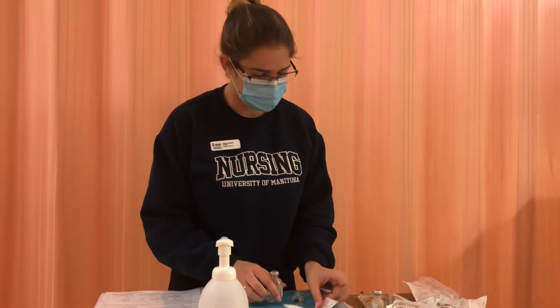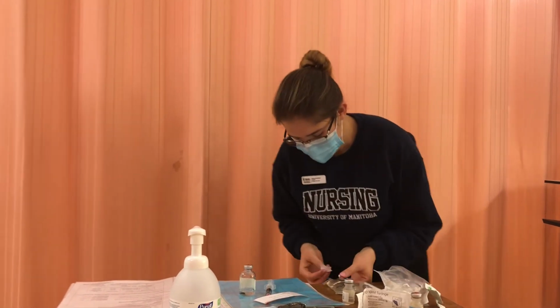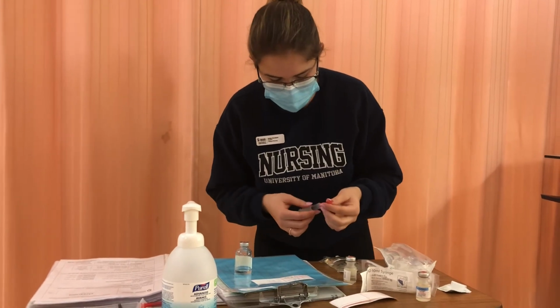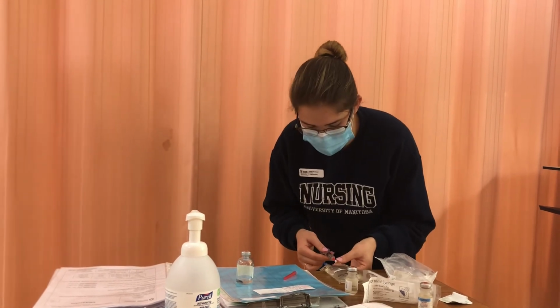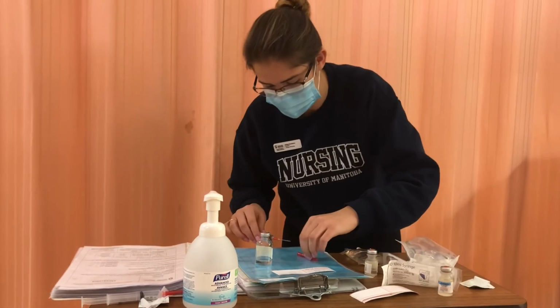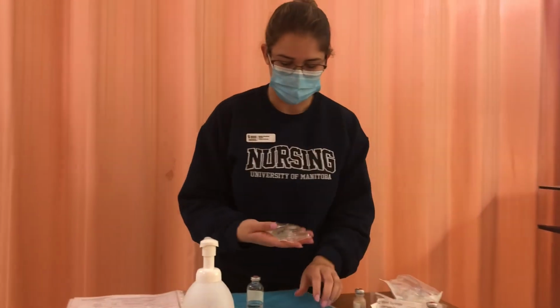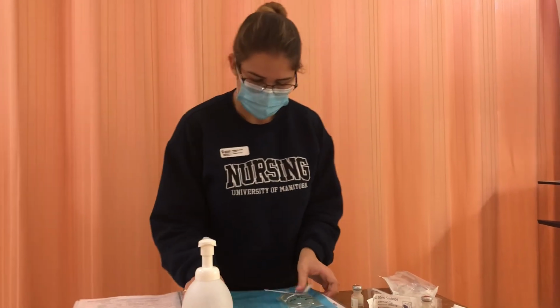Okay, so now I'm going to reconstitute, dilute. So I'd be grabbing a new alcohol swab, and I'm going to be cleaning the port on my med bag for 30 seconds. So 30 seconds has passed, and I'm going to insert my med. And I know that this is sterile because it was hanging over the table and it has not touched anything. So there goes my 3 ml dose, 750 milligrams. Okay, and I'm going to put that into the sharps container. I'm gently going to mix this to make sure that it's mixed properly, and I'm going to put on my label. So I'm going to grab all my supplies. I'm heading to the bedside.